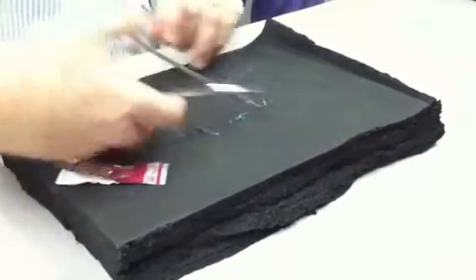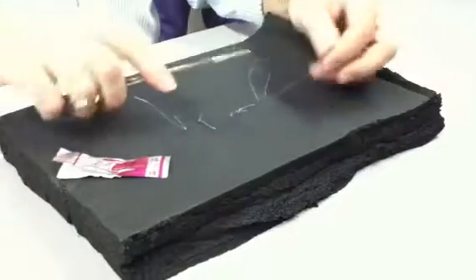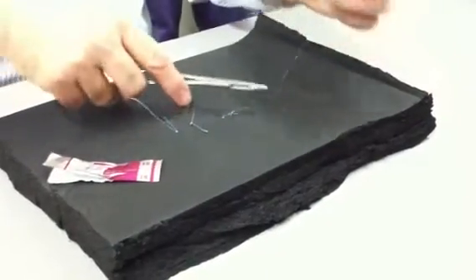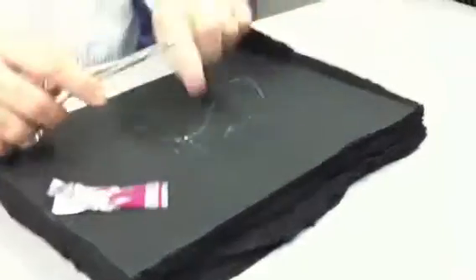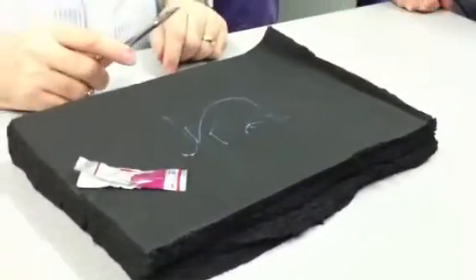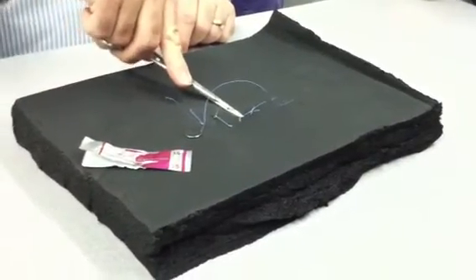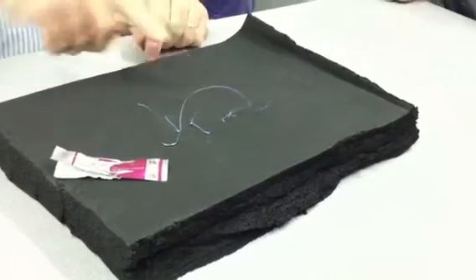Otherwise it's identical. I'm going to grab the tip, curl it out, come in here and gather. Now you can see when I tie — which I'll be tying in this direction now, because that's the way the knot's going to want to lay — it forms a horizontal mattress. Two forehands are cruciate; forehand and a backhand, you get a horizontal mattress.